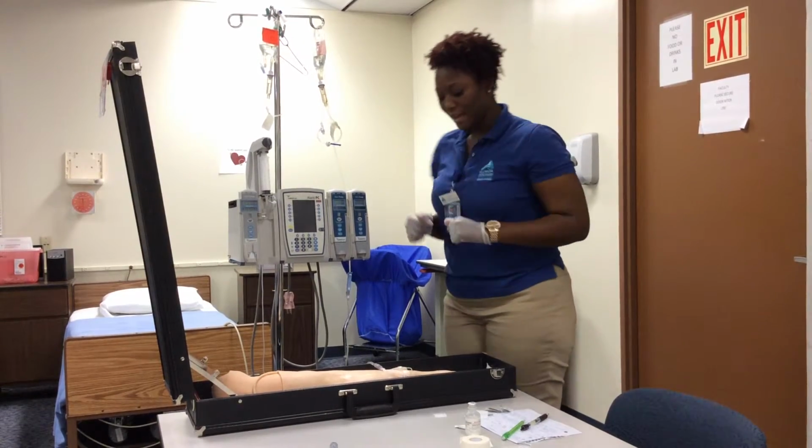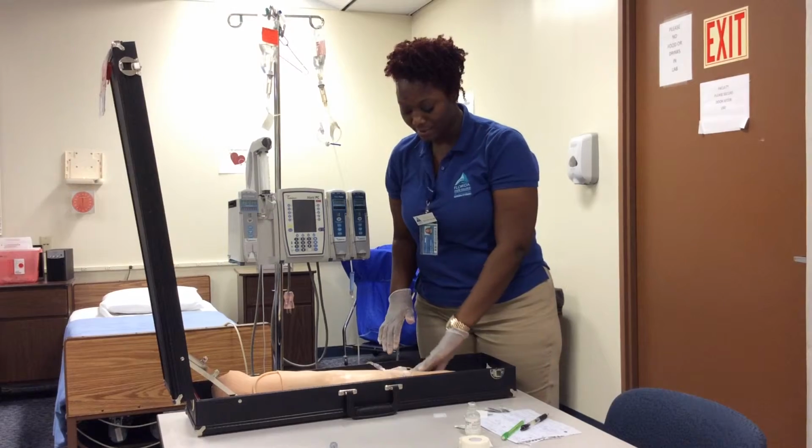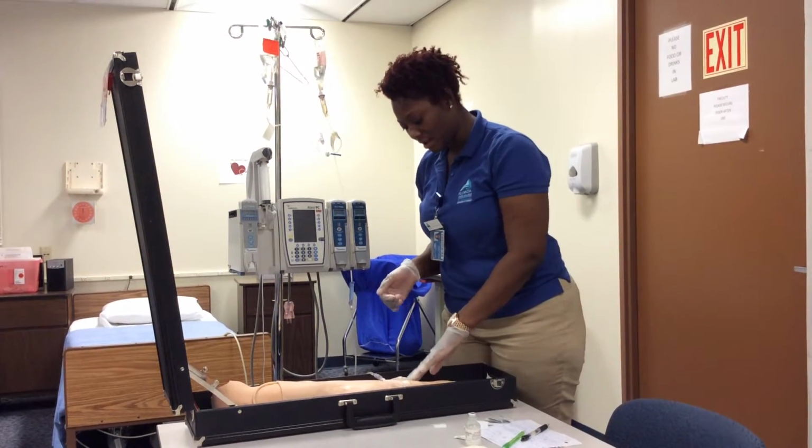Okay, good. Again, I'm going to check for any swelling, infiltration, or phlebitis, any pain or tenderness, with new gloves. Patient is doing well. Alright.